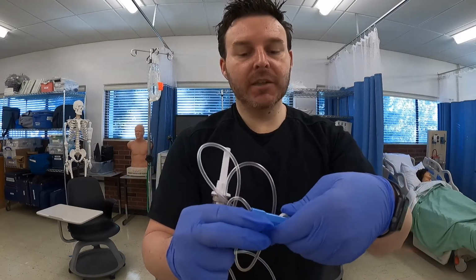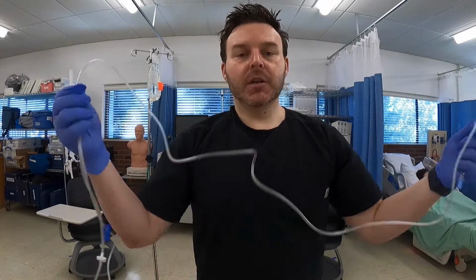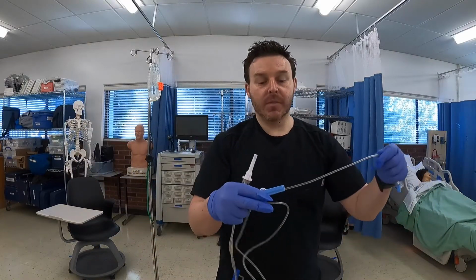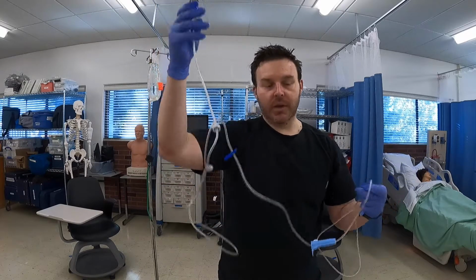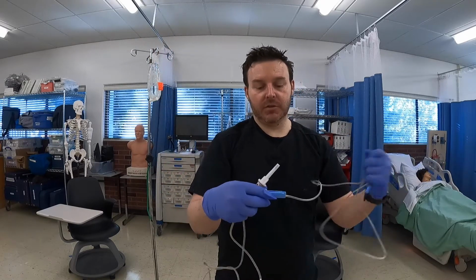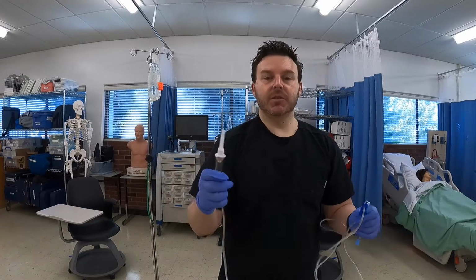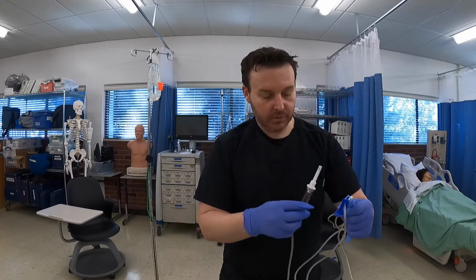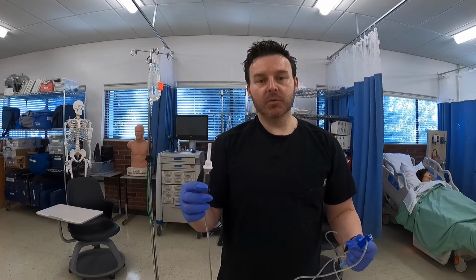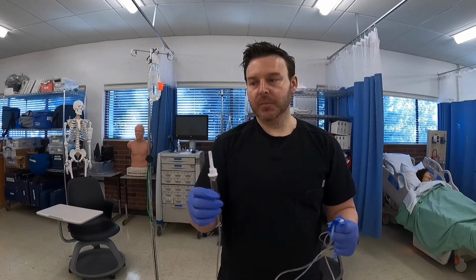So this is going to be our main controller when we're priming the tube, because right now it just came fresh out of the bag and it has a lot of air. It's all full of air, and so we cannot hook it up to the patient in this way. So what we have to do is spike our IV bag and then run some fluid in through here and get out all the air bubbles before we can hook it up to the patient.